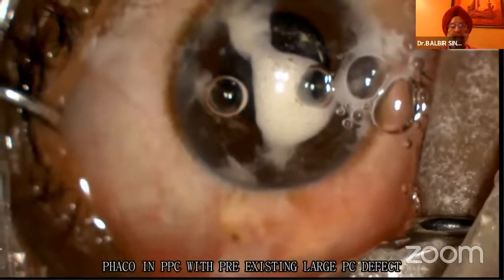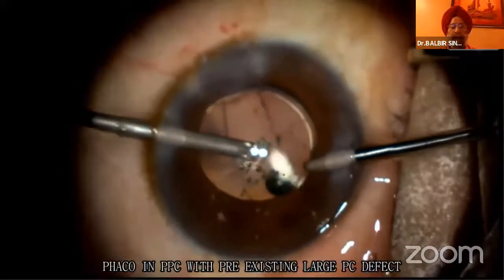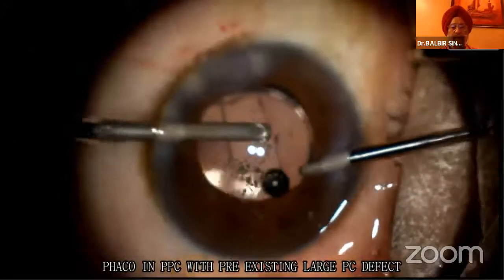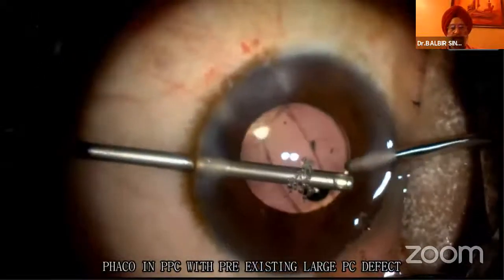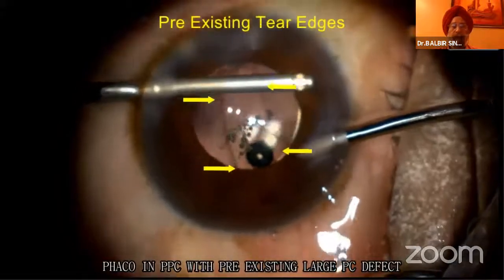Finally, irrigation aspiration is done with the vitrector only. Now you can very clearly see the tear, a big tear, which I've seen in 2 cases, and this one is being presented. The pupil is round.